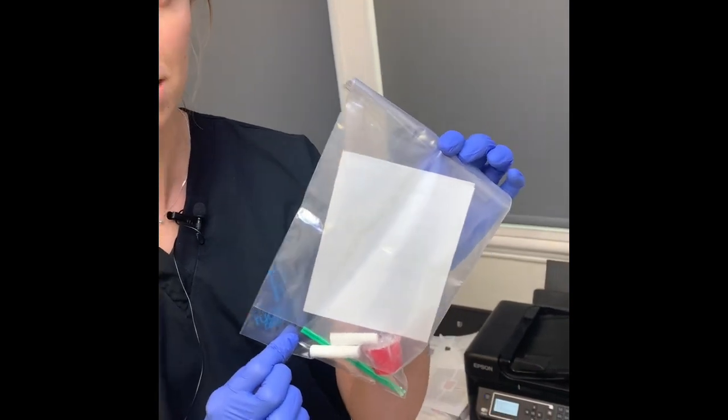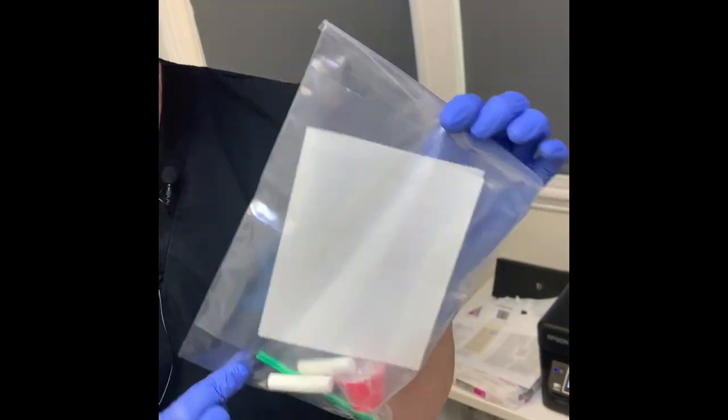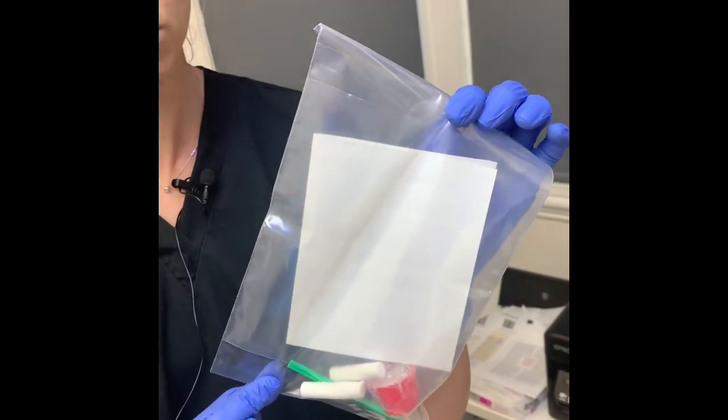— we've actually made up some kits of professional material that we use at the practice here for you to use. So please give us a ring if you have lost a filling and need something to pop in there just to keep the tooth protected.